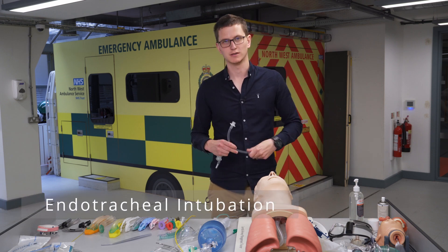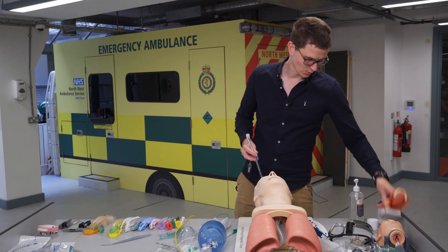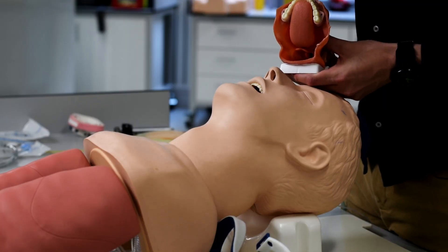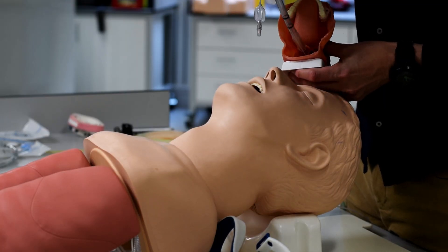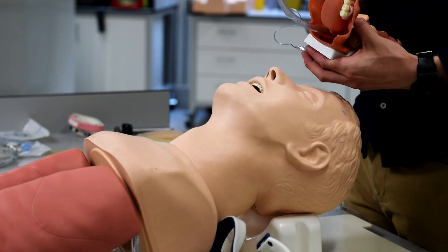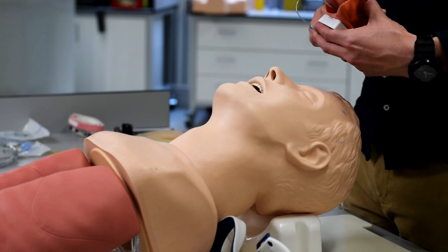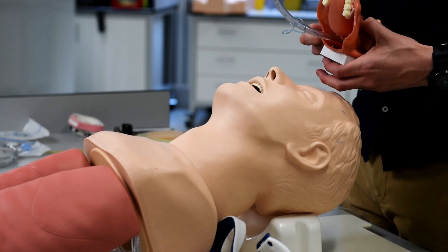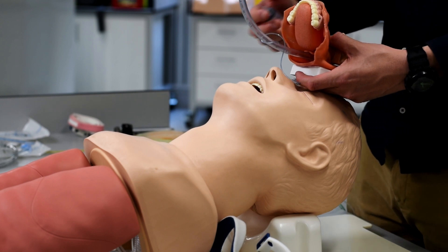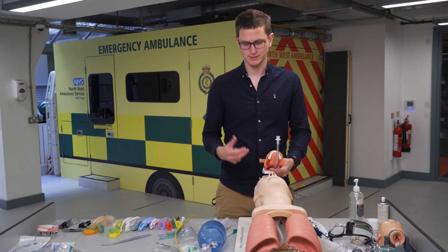Endotracheal intubation means the tube goes into the trachea — past the tongue and lodged in the trachea. You then inflate a cuff, which gives you a protected and maintained airway. If the patient is vomiting or there's blood in the airway, blood cannot get past this tube. This is the gold standard for airway protection.